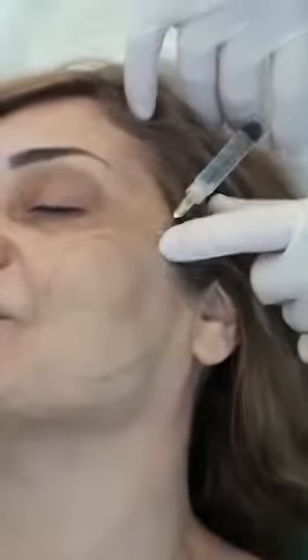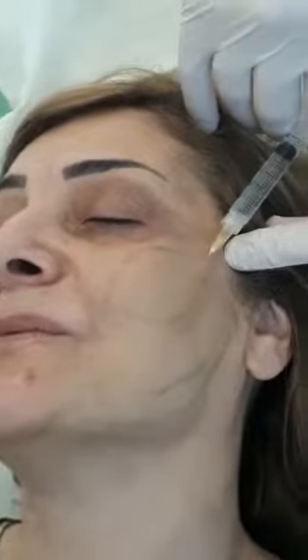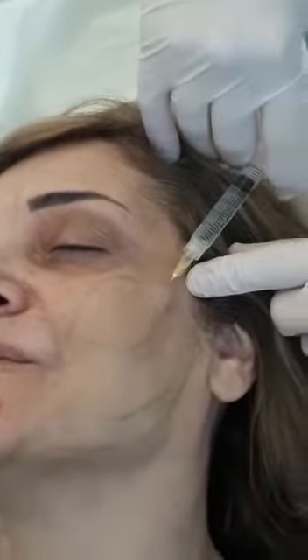It burns a bit, madam. Anesthesia. Here we are, points 1 and 2. Do you need light, doctor? Not now. It's okay. Then we wait a bit in order to let the anesthesia act.